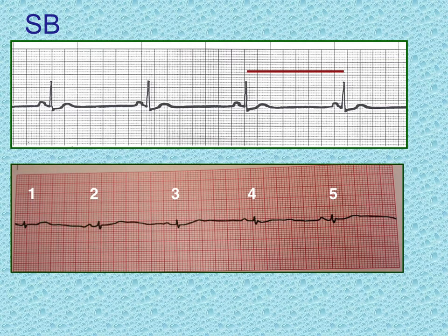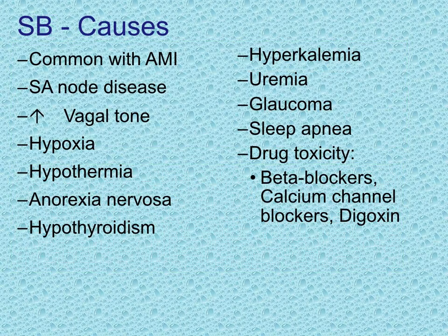So that indeed would be classified as sinus bradycardia. Let's look at some of the causes. You can see a big litany here, a long list of things that could cause bradycardia.